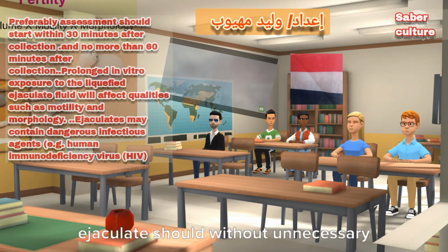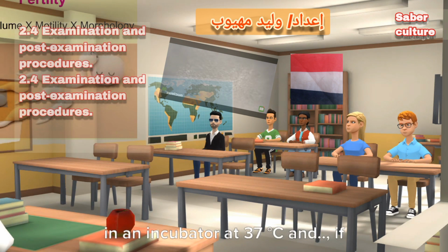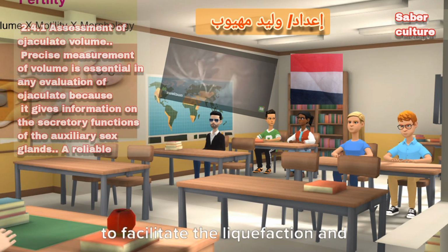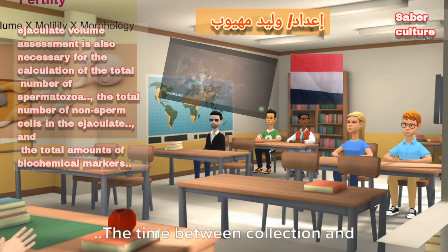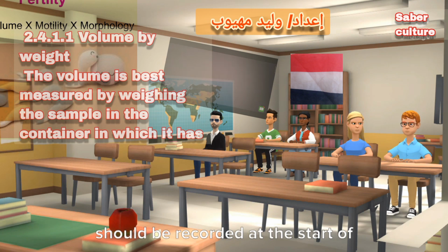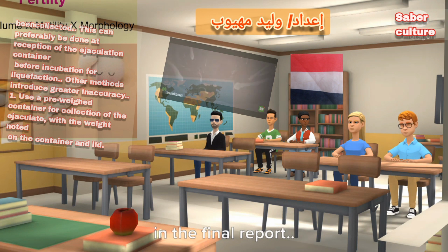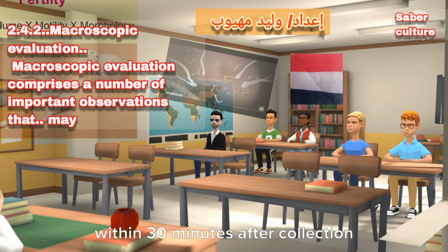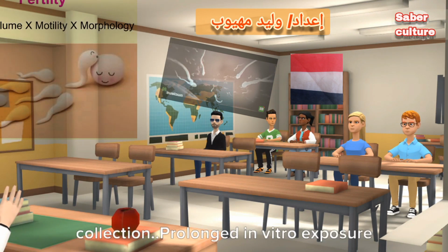Initial sample handling. The collected ejaculate should, without unnecessary delay, be allowed to liquefy, preferably in an incubator at 37 degrees Celsius and, if possible, on an orbital mixing platform, to facilitate the liquefaction and mixing of the specimen. The time between collection and the start of the ejaculate examination should be recorded at the start of macroscopic evaluation and presented in the final report. Preferably, assessment should start within 30 minutes after collection, and no more than 60 minutes after collection.